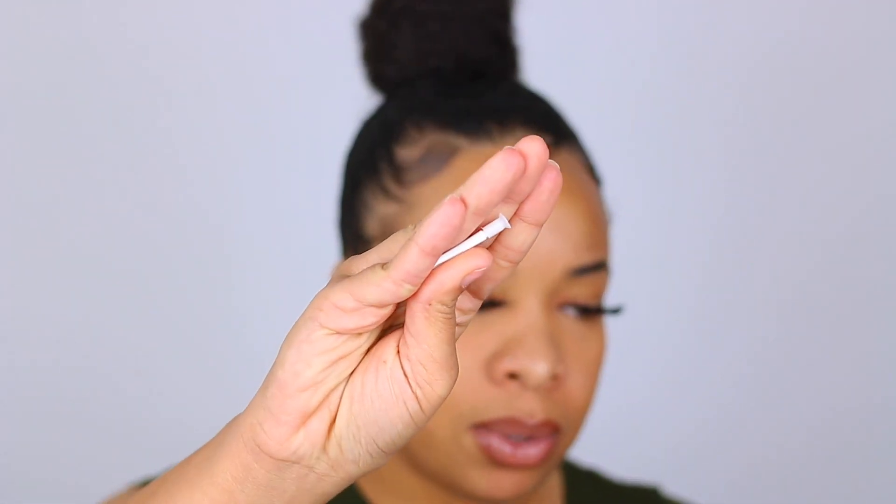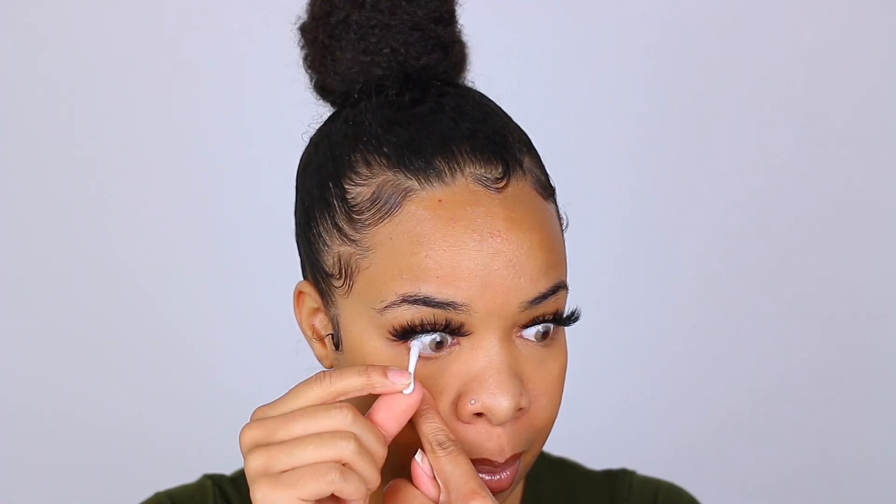It comes with this tool right here, and this little tool helps you put on your lenses. I like to use it because all I do is set it on there, pull my eye down, pop it in, and boom — blink a few times and it's pretty much done.